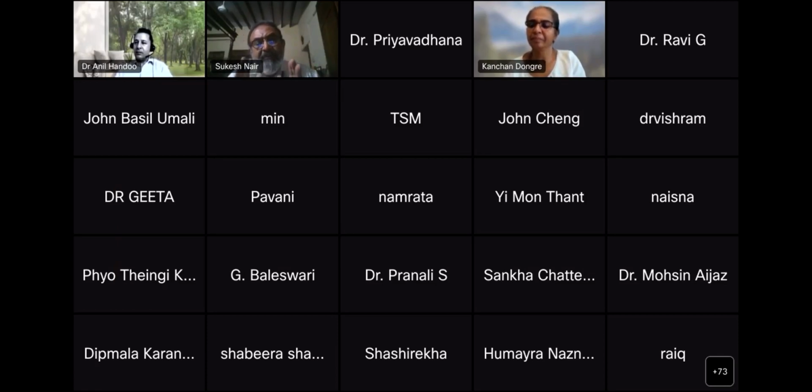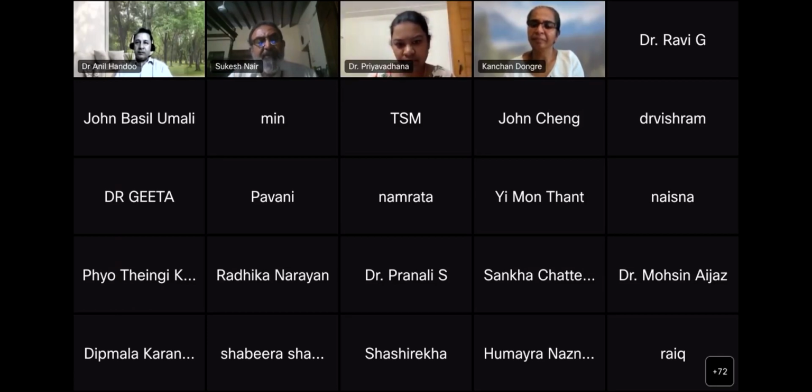So now what happens in this cell counter is when patients have spherocytes, they are not able to take in that much water, and the spherocytes rupture because there is a problem with the volume inside the red cell. And when they rupture, obviously they record lower volume. So the mean sphered cell volume in patients with hereditary spherocytosis, or patients who have spherocytes, is always lesser than the MCV, which was measured on normal red cells in the impedance channel or the red cell histogram.